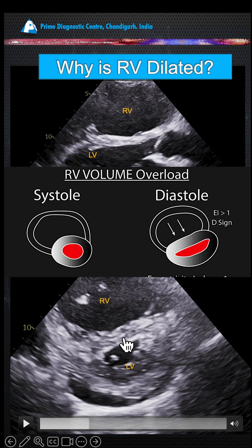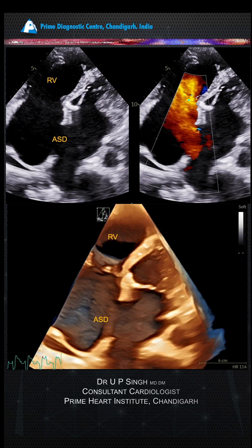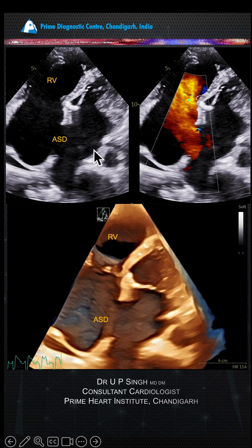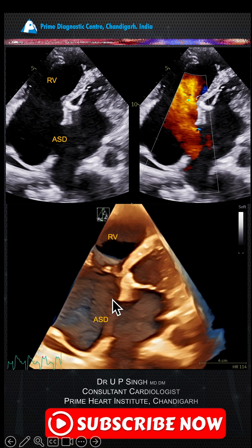If the D-shape happens during diastole, this is volume overload. The commonest reason is ASD with a large shunt from LA to RA to RV in diastole, producing a diastolic overload.